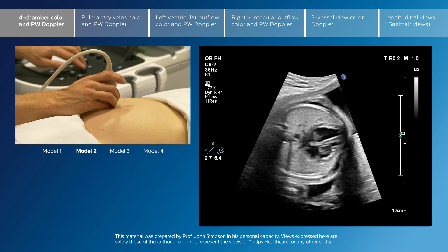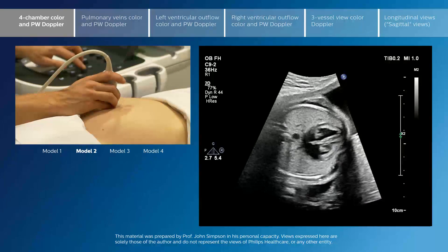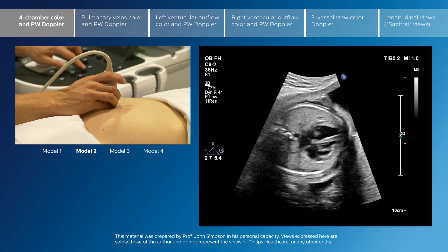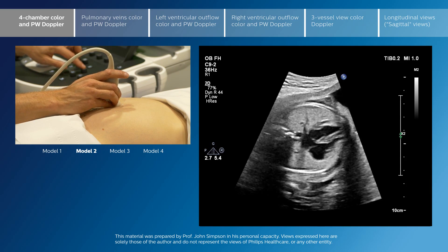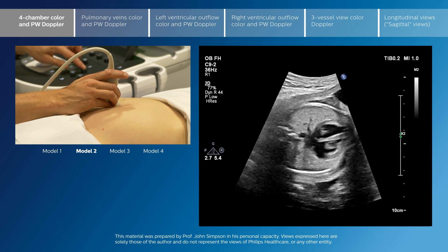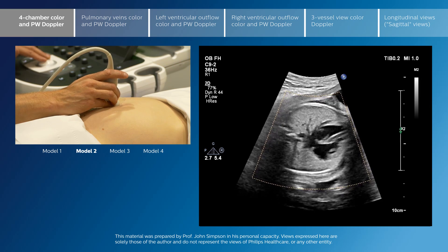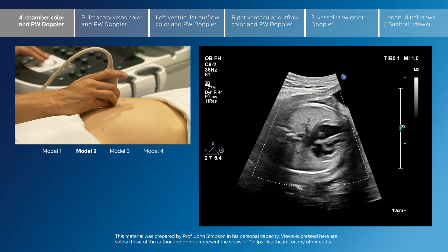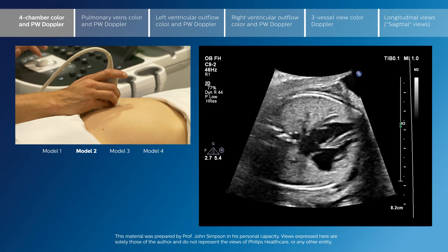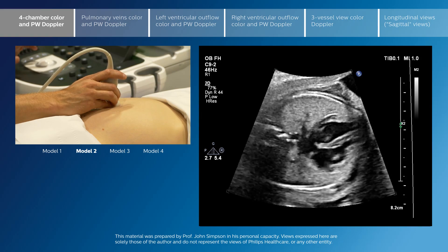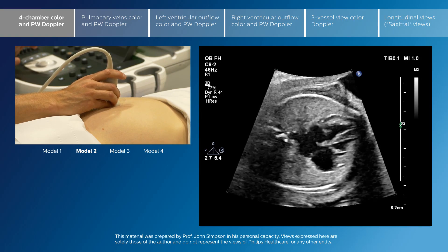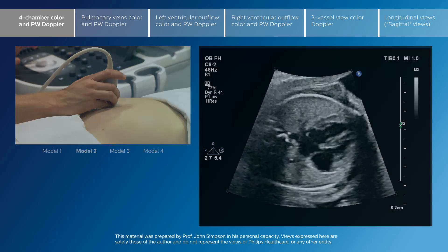Now we're going to start with some more advanced views of the fetal heart. I would emphasize that the starting point for anyone is to make sure that the core screening views are normal and to start with cross-sectional imaging before moving on to any of the more extra modalities that we're looking at here.